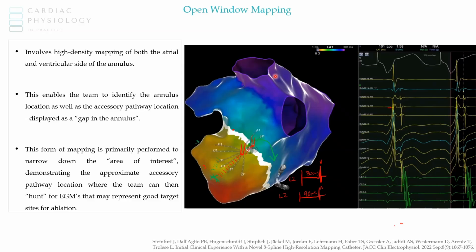And then we can start to look for our VA fusion at that point, and that can tailor our ablation strategy.